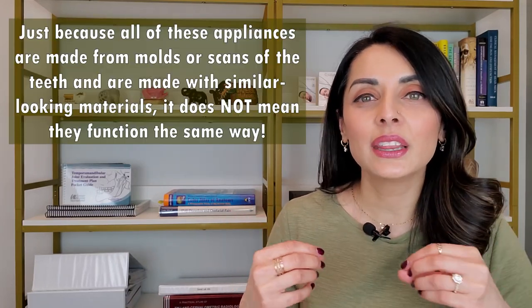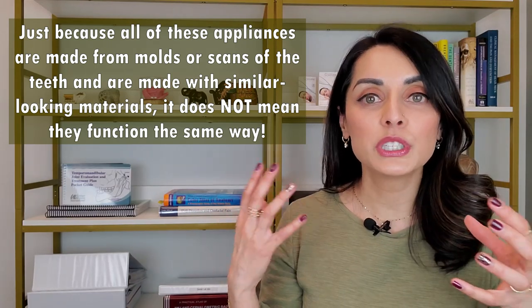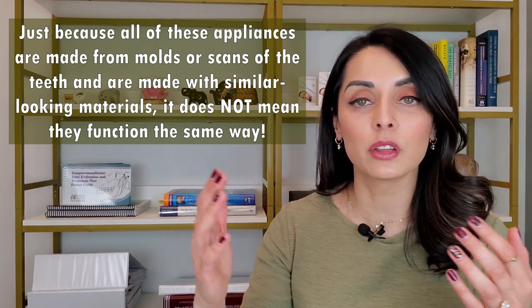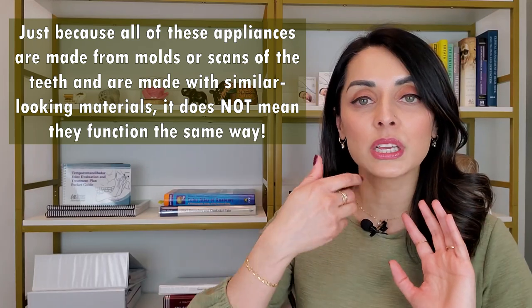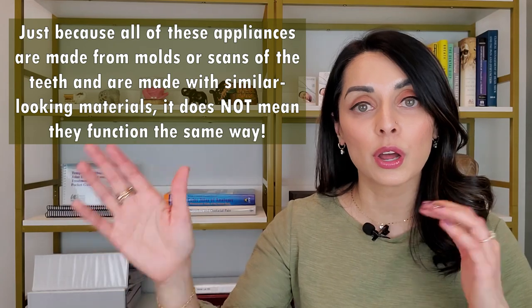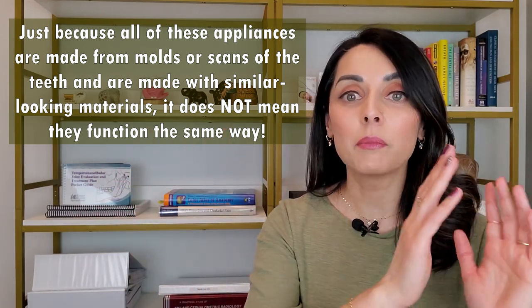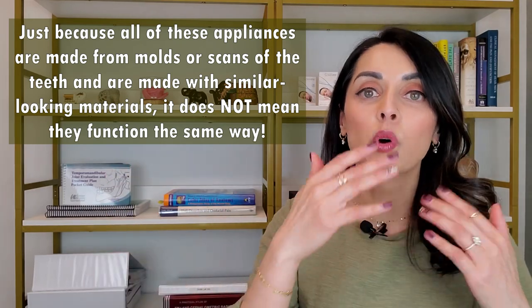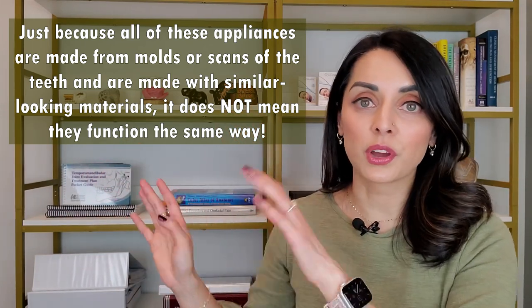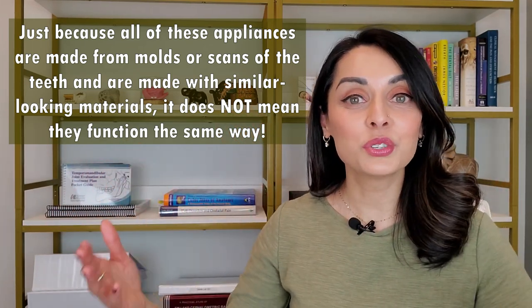Keep in mind that all of these appliances are made from molds or scans of the teeth. Because they're made similarly and use somewhat similar materials, there can be a lot of confusion as to the exact difference between all of these appliances. Keep in mind that once the impressions or scans are taken, there's often a lot of lab work going on in the background that you never see that makes each appliance very different — whether it's a bleaching tray, a retainer, a night guard, or a TMJ orthotic. Again, very different. So let's move on to retainers.